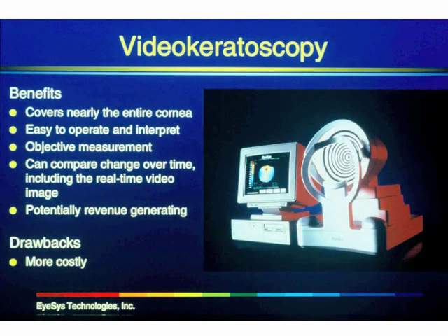Okay, and this is a picture of an early computer video keratographer topography unit that took the Placido disk images and calibrated them.